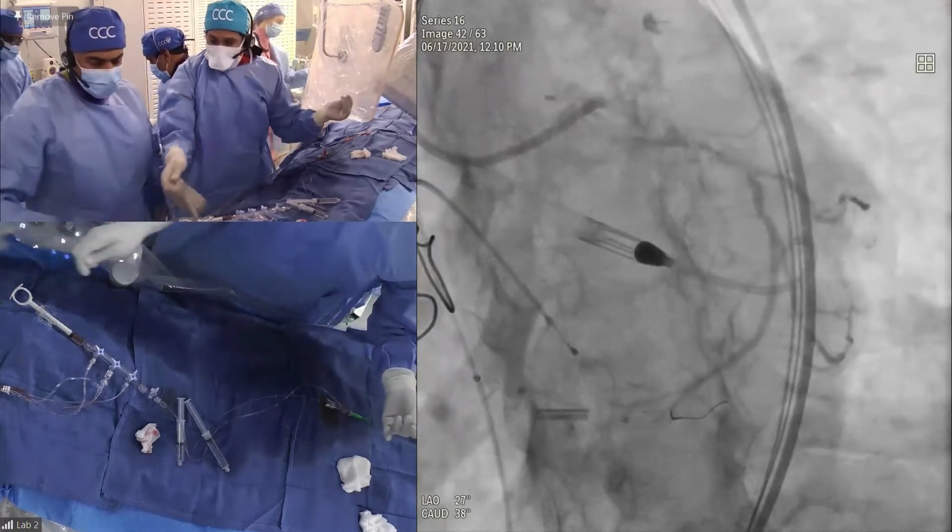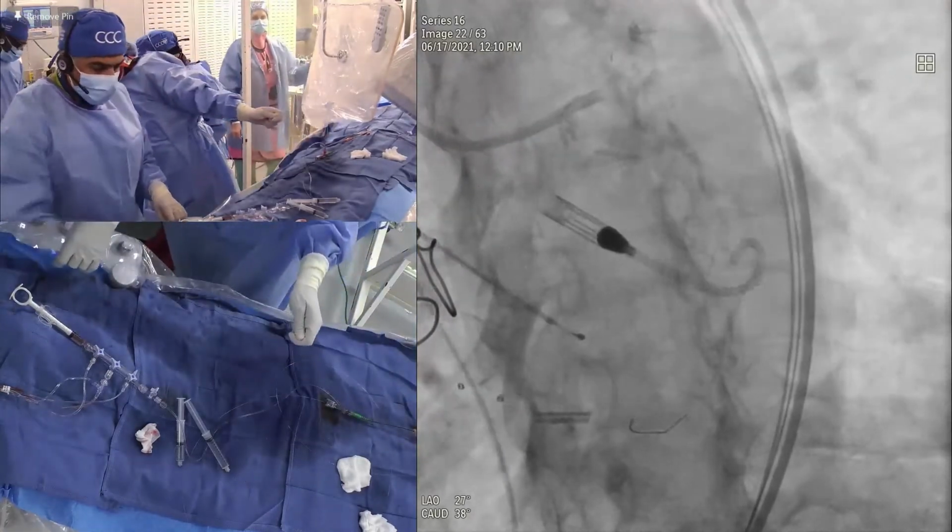But I don't know how much ablation you got done with that small burr. So I think that's the question.